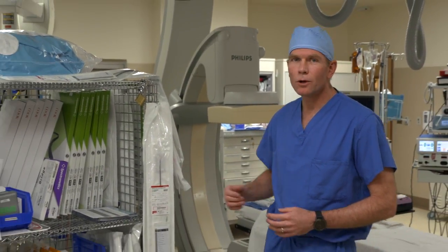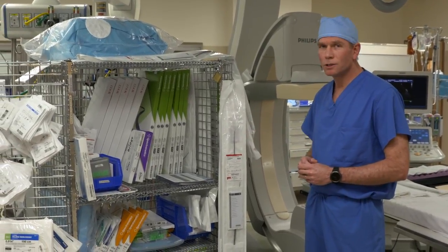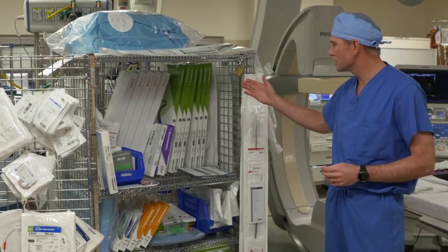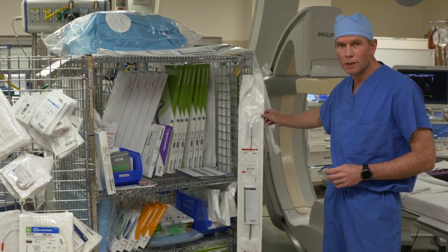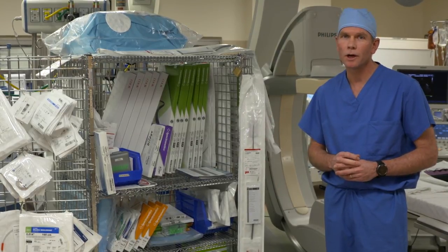On the right hand side you can see our equipment cart where we have a variety of advanced tools for extraction, including laser sheaths and mechanical sheaths, as well as a bridge balloon. In addition, we have long femoral extraction sheaths and snares that can be employed for an extraction via the femoral vein.